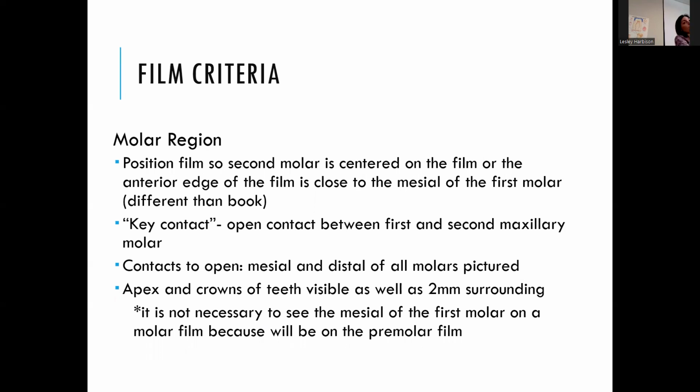As long as you've centered the second molar, it's fine. And if you do get the mesial of it, great. If not, likely you have it in the premolar shot.